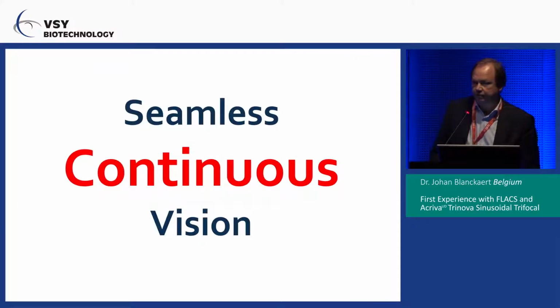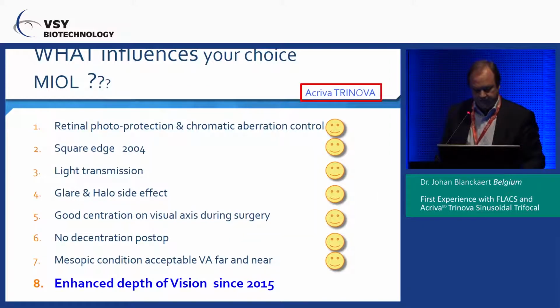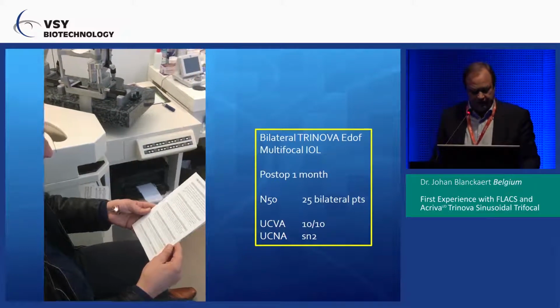What about the latest development, which is the seamless continuous vision? I have to say I was skeptical about it when they first presented it to me, because I said, but we still have physiological limitations of our IOL. Then the enhanced depth of vision became really something which I appreciated by doing some tests with my patients.